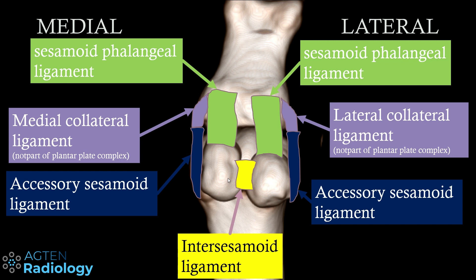Let's start with the intersesamoid ligament. It's basically just connecting the two sesamoid bones — very easy to see, especially on short axis views, which we will see later. This is one part that can get injured, though it's not frequently the case.